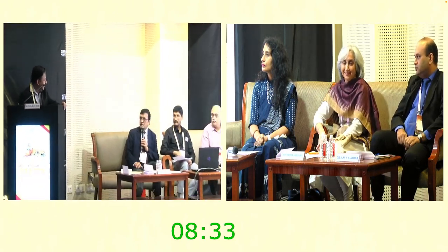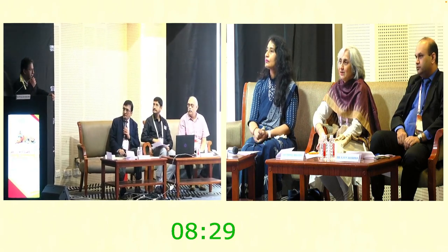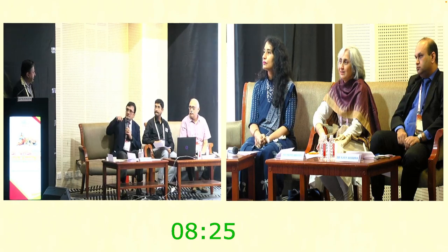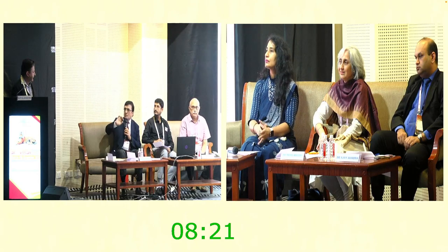Supposing now it's got side cutting edges and a tip which is sharp. Supposing I use a 26 gauge long needle, which is 32 millimeters long, I can virtually get the same instrument made. Is it different? The one difference is, sir, it's slightly curved and slightly long. It's a normal needle. It's 32 millimeters long. I can curve it the way I want to curve.